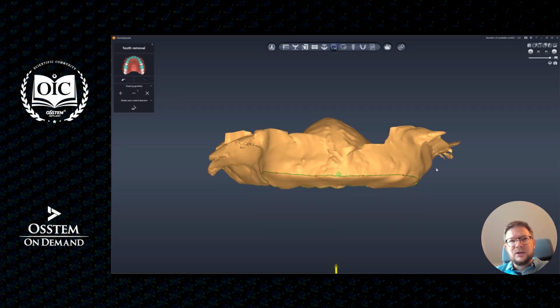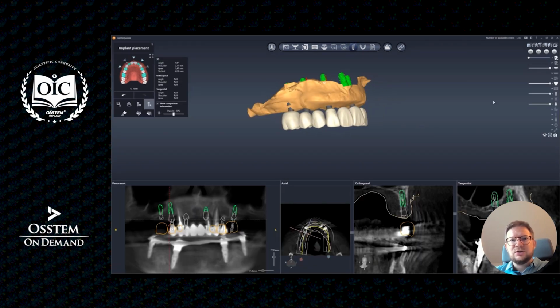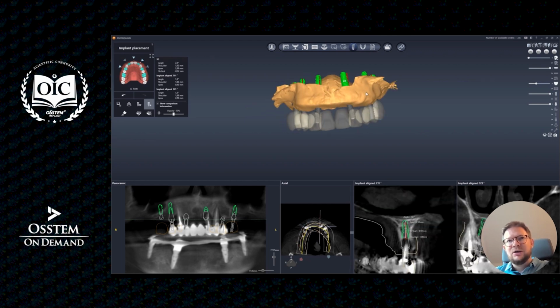Then, to finish this presentation, I would say that sometimes we need to combine different solutions.